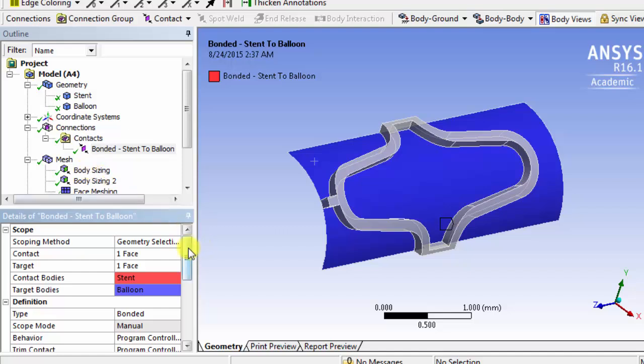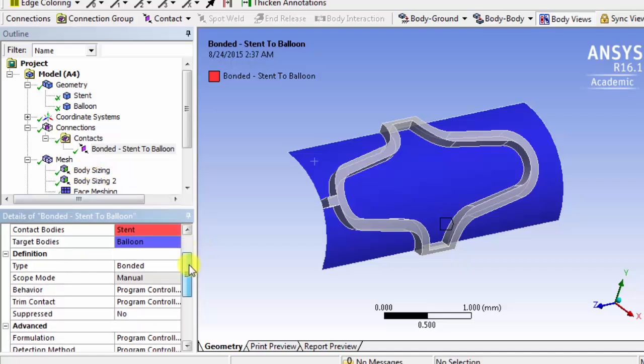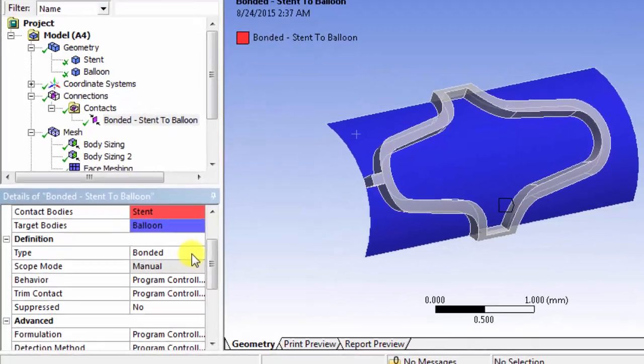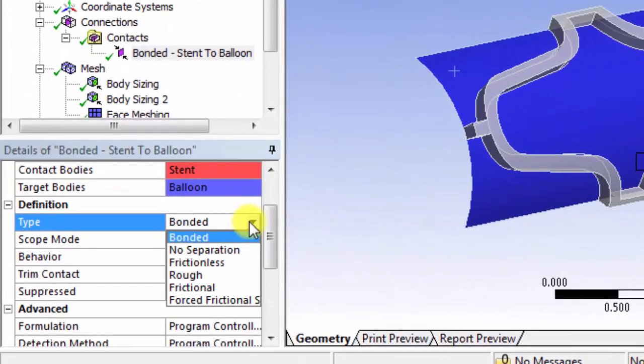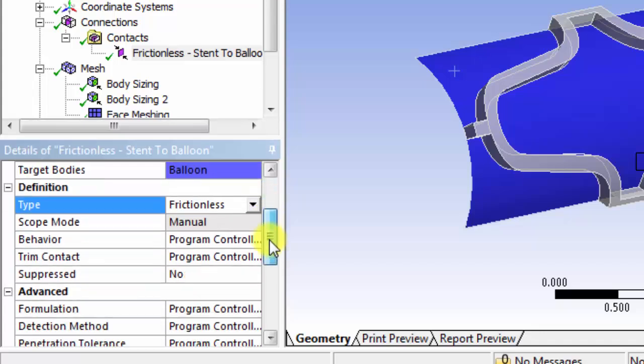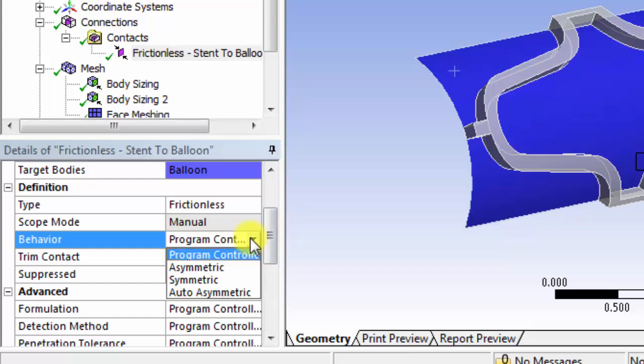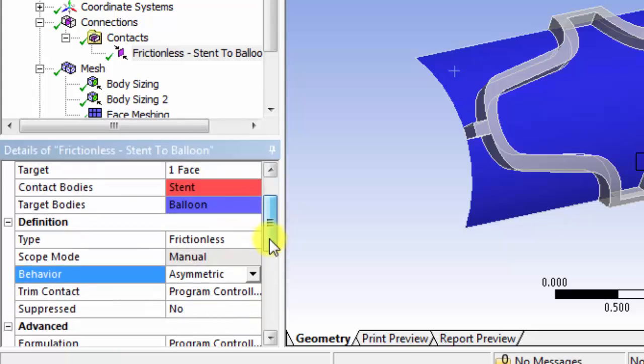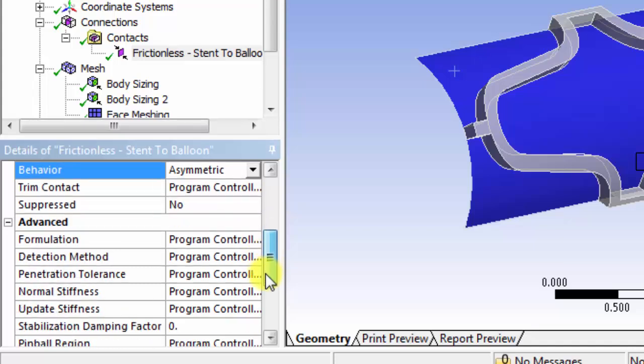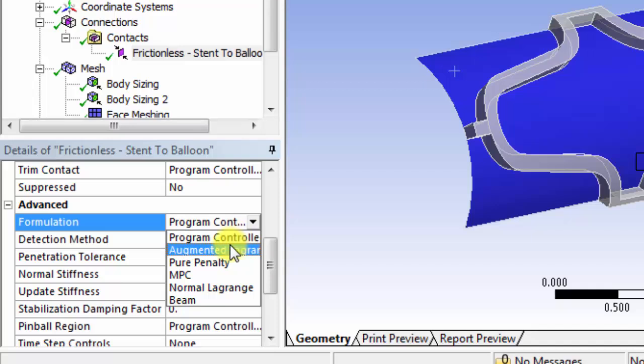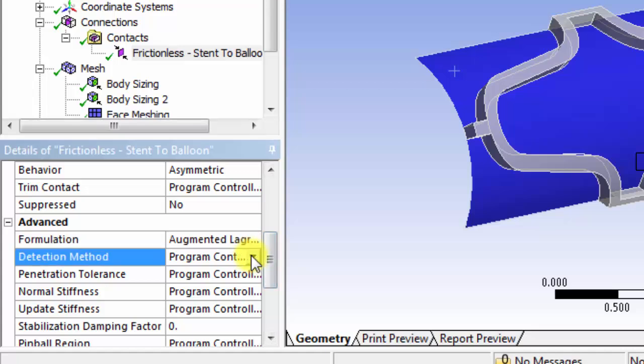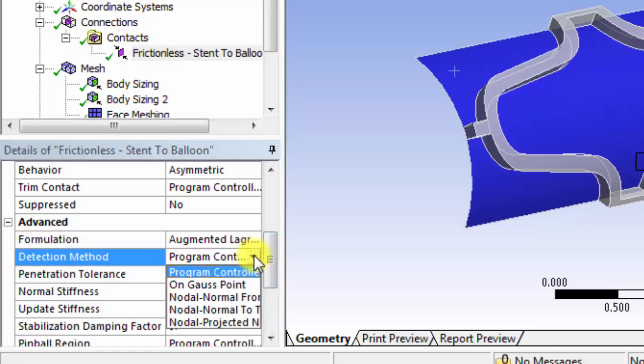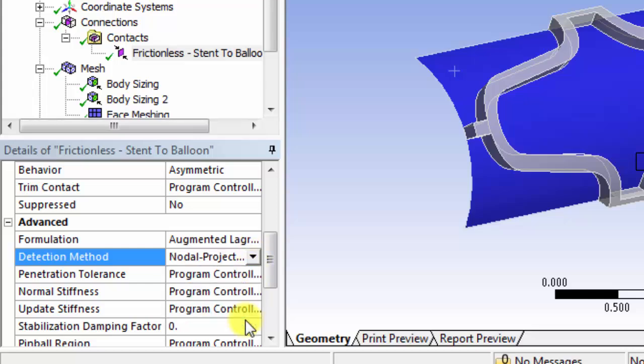Next, we'll define the type of contact that this is. So the type will go from bonded to frictionless. We'll say that the behavior is asymmetric. Under formulation, detection, we'll select augmented Lagrange. Detection method will be nodal projected normal from contact.